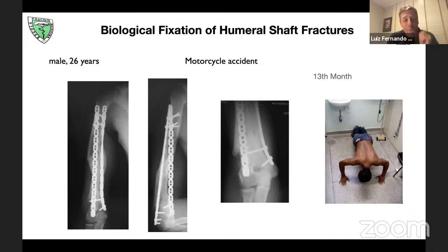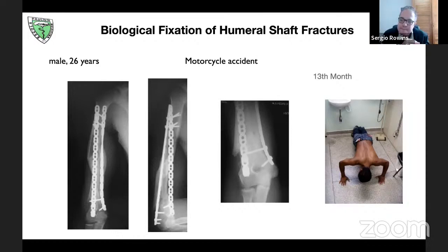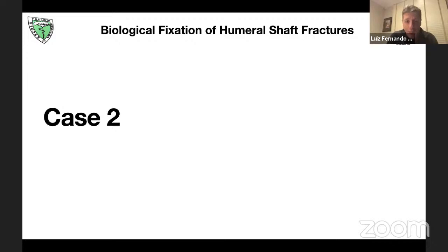He knows that I'm really a nailing guy, but like Dr. Shiva said, I don't think I have to say bad words about plating to say that I prefer nailing. With both, we can fix thousands of fractures, and the trick is to identify the right patient with the right fracture, with the right surgeon with the right skills to fix the fracture. So you can have good results with both situations. To finish, oh my God.